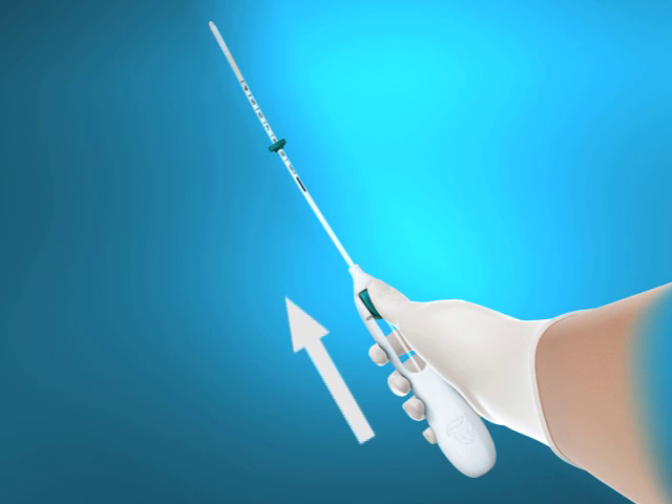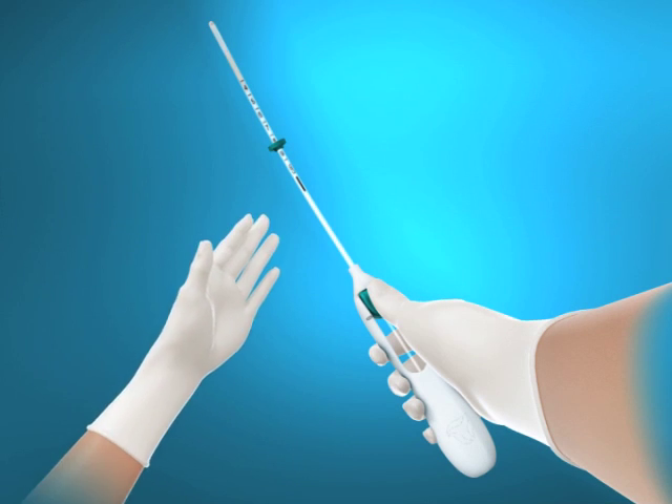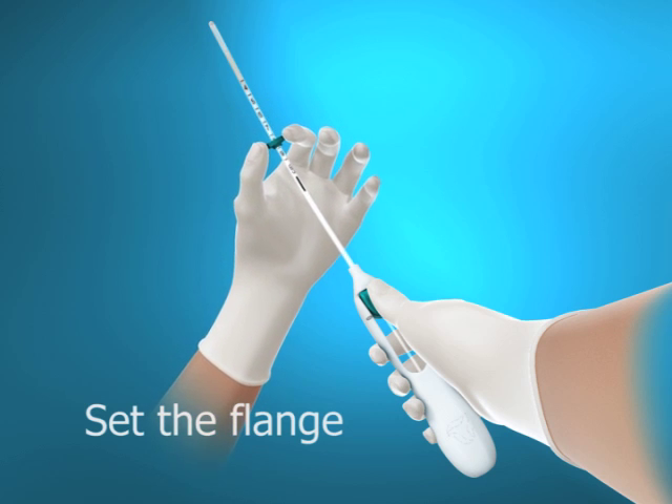Push the slider forward in the direction of the arrow to the furthest position to load Mirena into the insertion tube. Do not pull the slider downwards as this may prematurely release Mirena. Once released, Mirena cannot be reloaded. Holding the slider in the furthest position, set the upper edge of the flange to correspond to the sound measurement of the uterine depth.